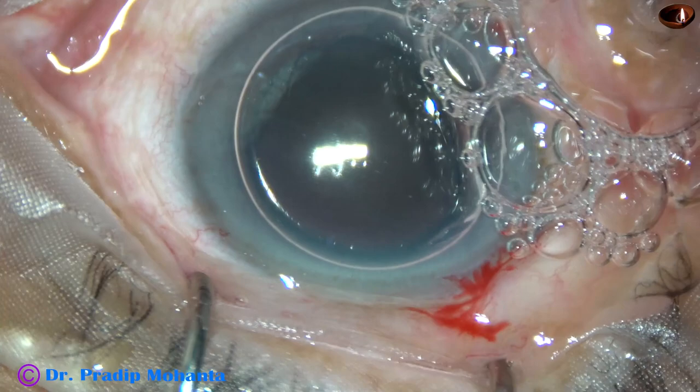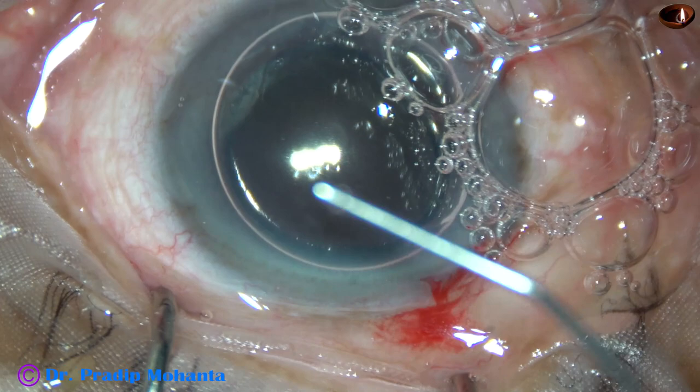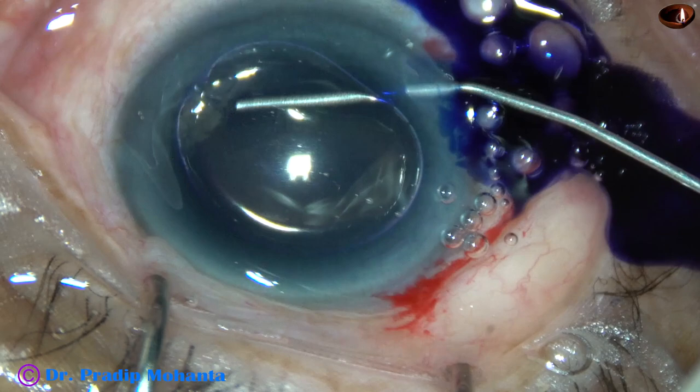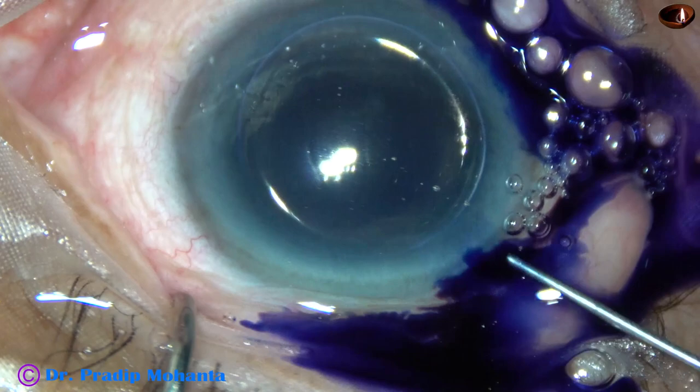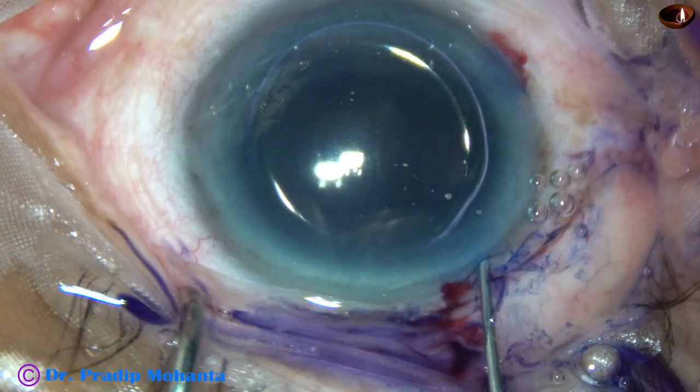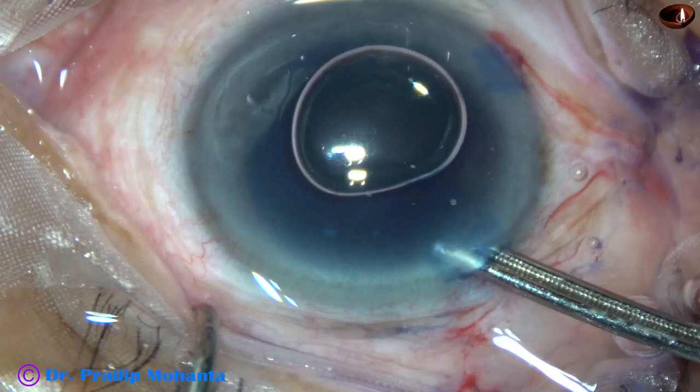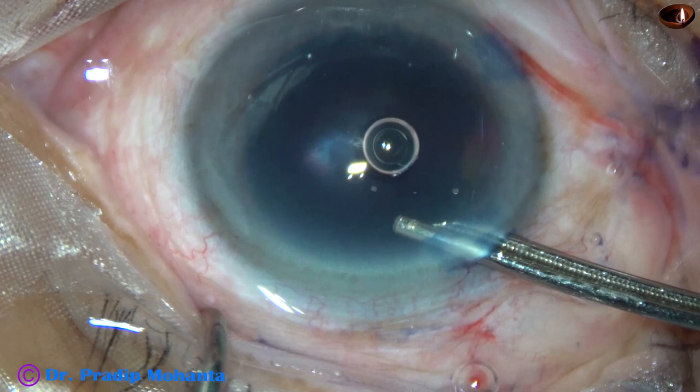An air bubble is injected into the anterior chamber. And beneath this air bubble, trypan blue 0.06% dye is going to be injected. Why stain this capsule? Because we will get some contrast to do capsulorhexis if we stain the capsule. This is a bit of adrenaline to maintain the dilatation of the pupil. The dye is thoroughly washed out.